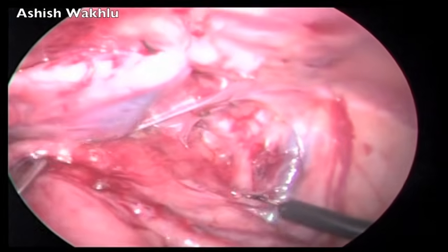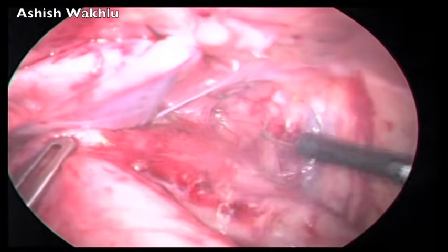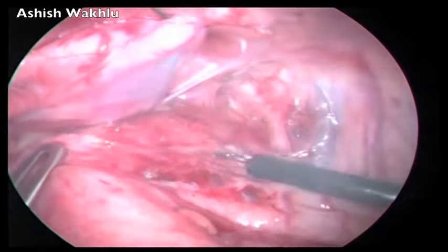When convenient, the hand instruments are changed from the right to the left side to facilitate the dissection.